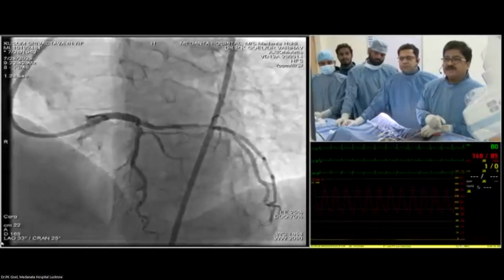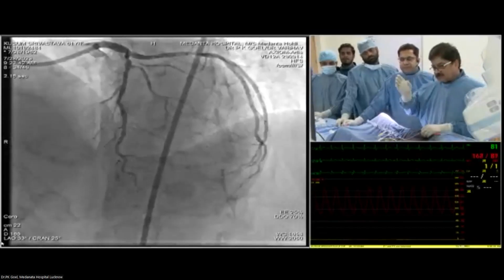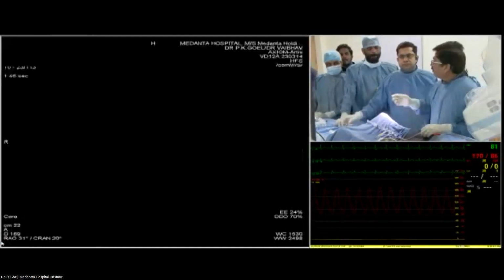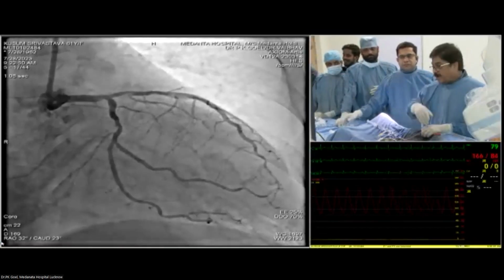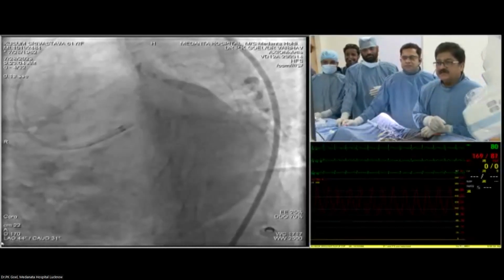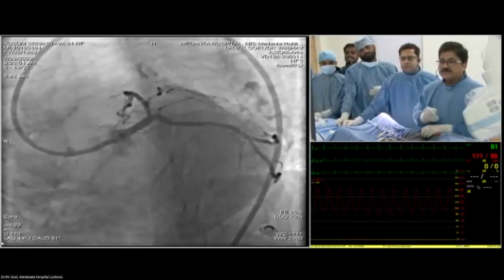So this is the left angio, left anterior oblique cranial view, as you see. In this, you see the proximal and ostial LAD looks diseased and irregular. The circumflex looks okay relatively. Next. That's a spider view which shows the ostial LAD disease, which is at least 85%, I would say. And the circumflex ostium also has some disease. We'll see it better in some other views. Next.